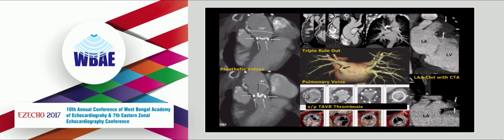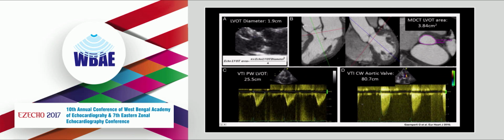There are some new diseases that are being diagnosed. Here is a status post TAVR valve at pathology which showed thrombosis, and if you go back and looked at their CT, you see this CT lucent area. These correspond to fibrin clots, and this is becoming a very important problem as evidenced by Raj Makkar's paper in the New England Journal of Medicine last year. You can give anticoagulation, it appears these disappear after that, and so the CT might be a great way of following such patients.